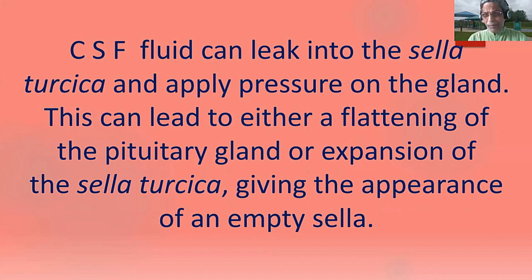Primary empty sella, what do you mean by that? The diaphragm sella, the dura mater above the sella, has some defect which can allow the CSF to pass into it, compressing the pituitary or enlarging the sella. This is called primary empty sella.